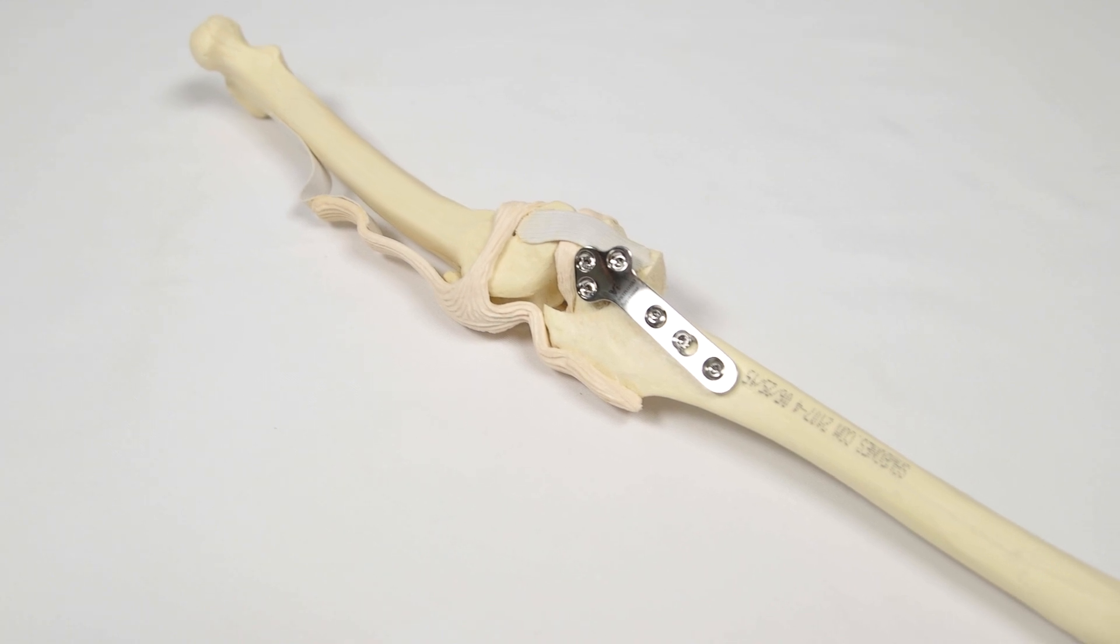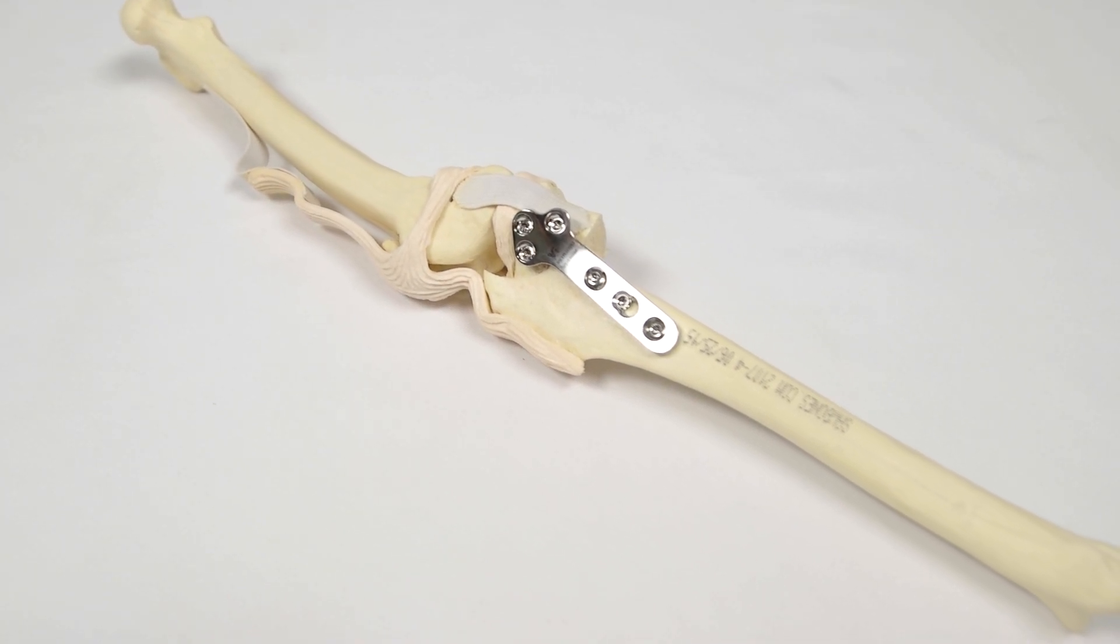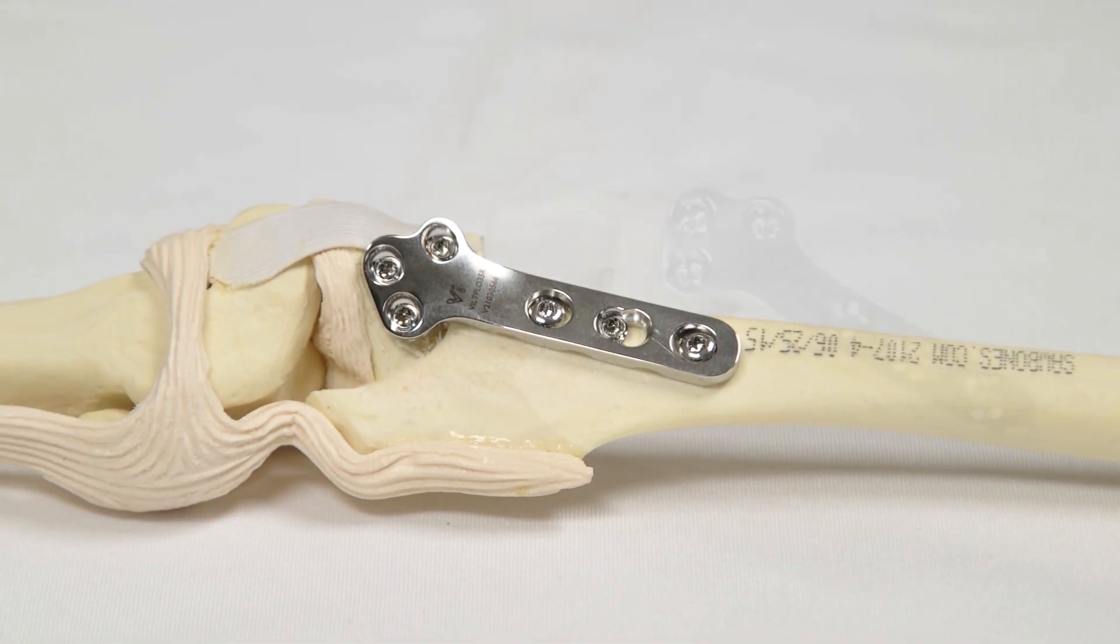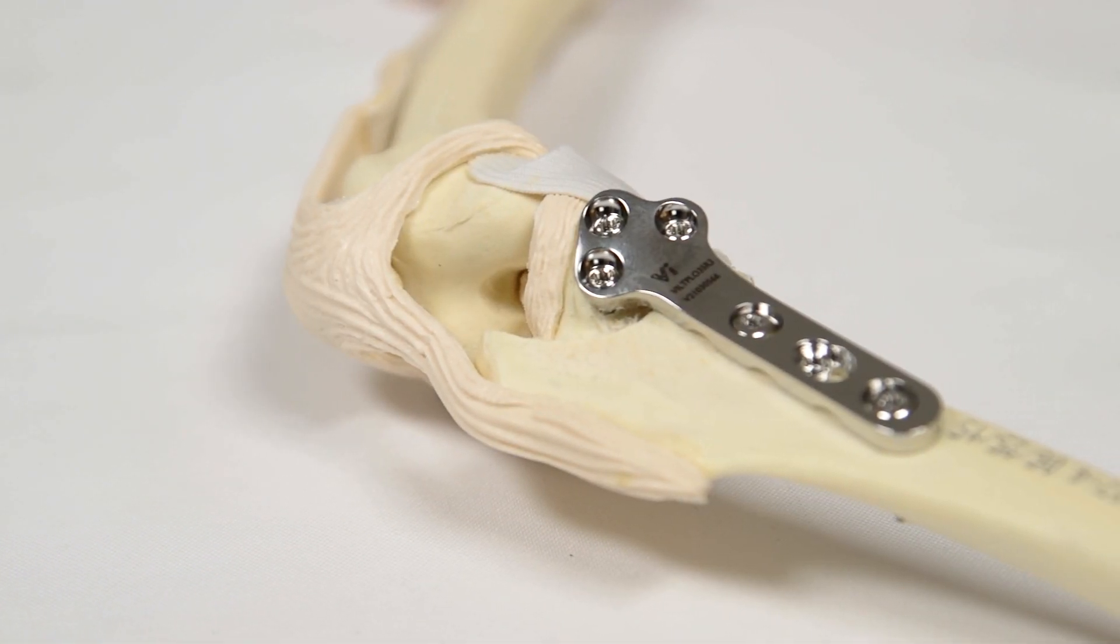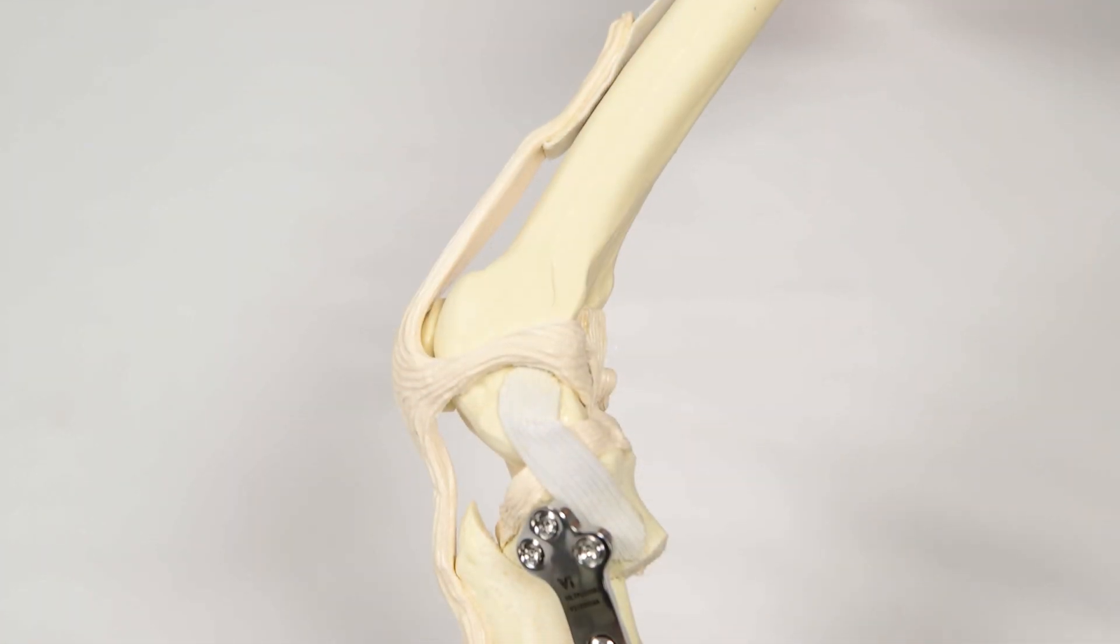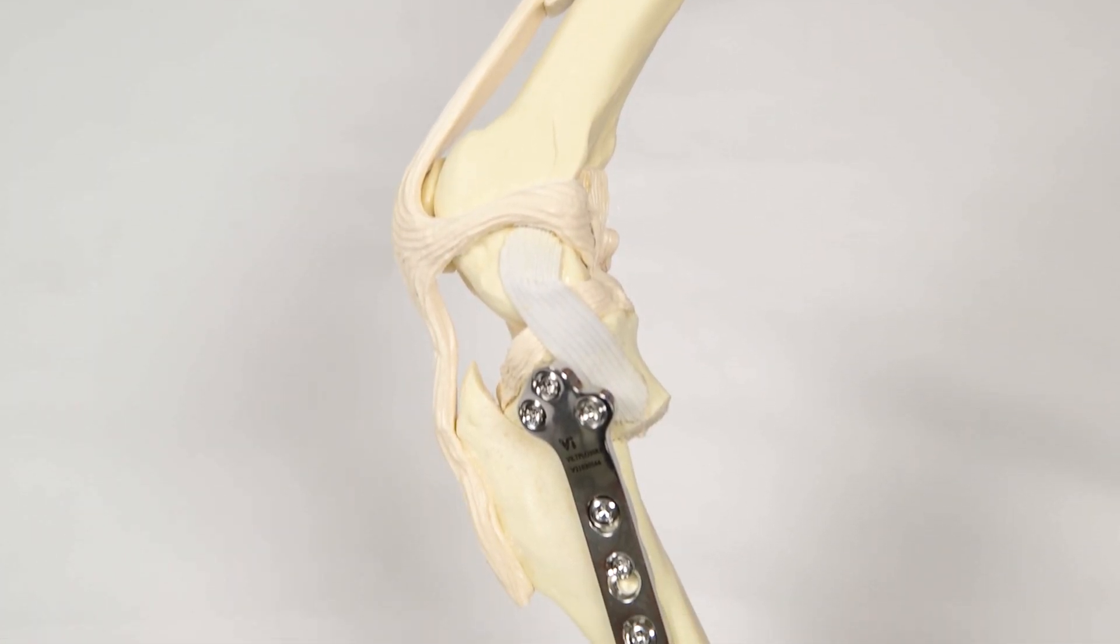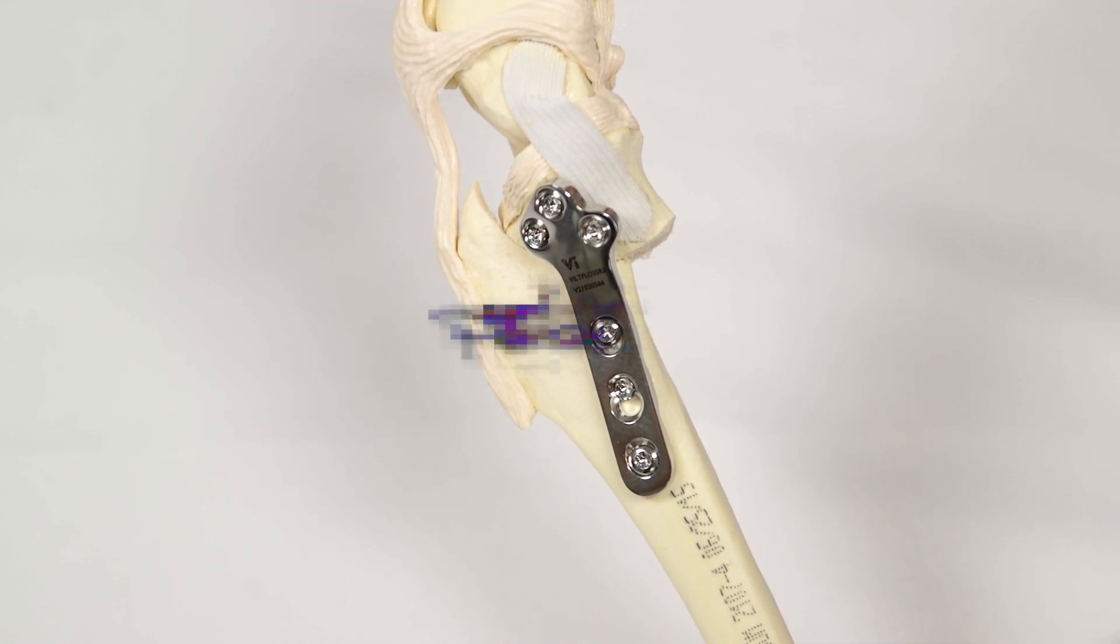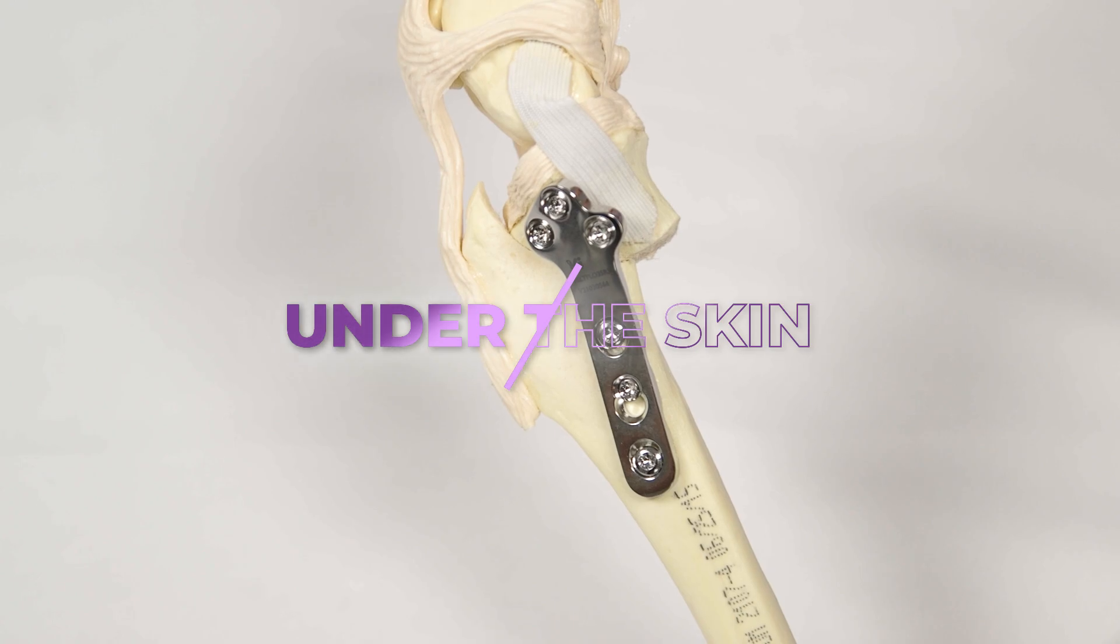We are looking at radial cut tibial plateau leveling osteotomy, or TPLO, using a locking plate for stabilization of the stifle following cranial cruciate ligament rupture. This procedure alters the functional geometry of the stifle joint to restore stability during weight-bearing. So, let's go Under the Skin.